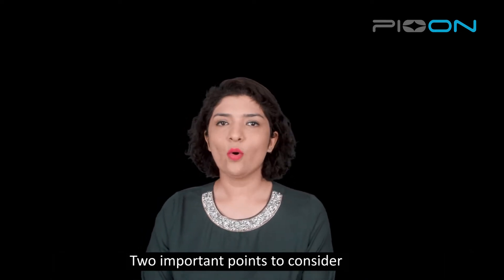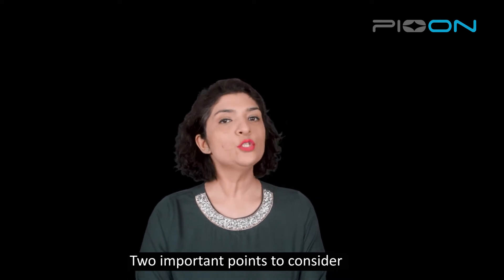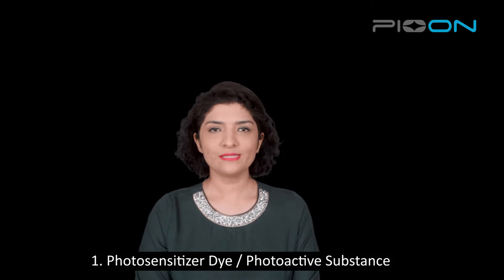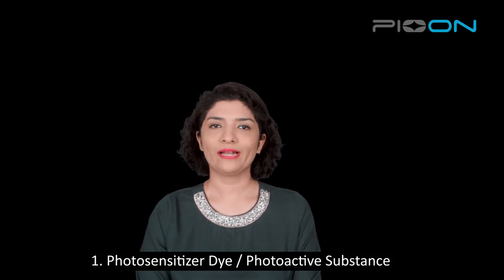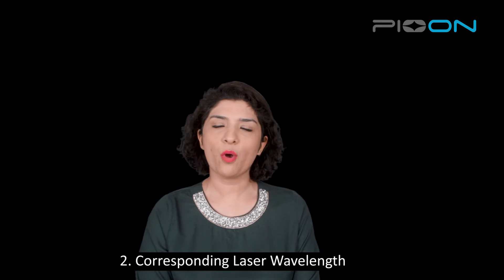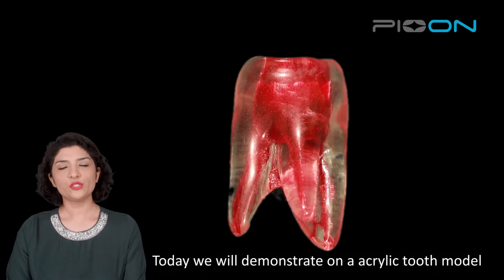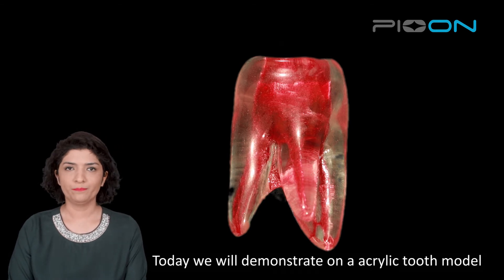Before we go ahead with the procedure, there are two important points to consider. Number one is the photosensitizer dye or the photoactive substances, and number two is the corresponding laser wavelength. Today, we will be demonstrating the procedure in an acrylic tooth model.